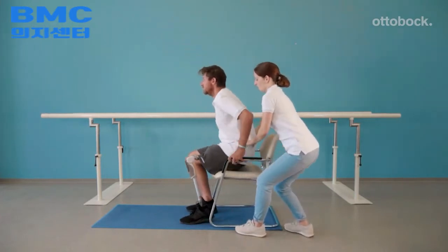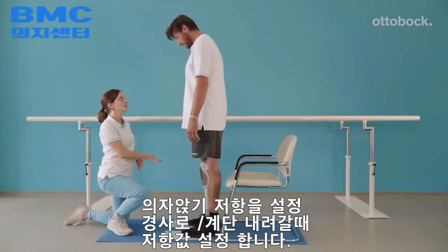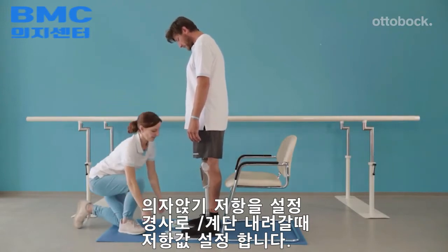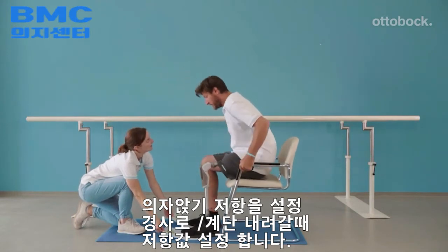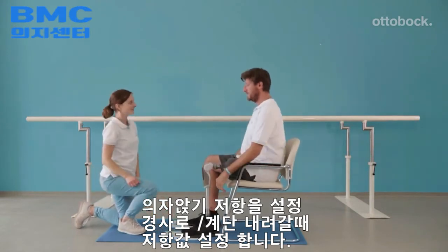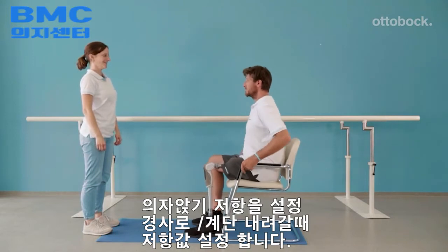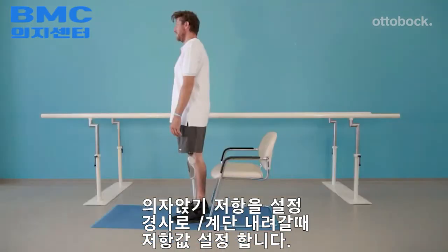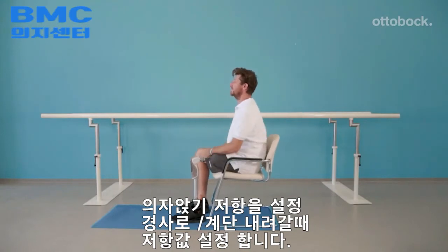Use two cards to test if weight is evenly distributed on both legs. When the weight is evenly distributed, the therapist cannot pull the piece of paper away while the model is sitting down. When the model is confident enough, he should practice sitting without assist and the therapist can correct as necessary. An adjustment of stance flexion resistance might be necessary by the CPO.